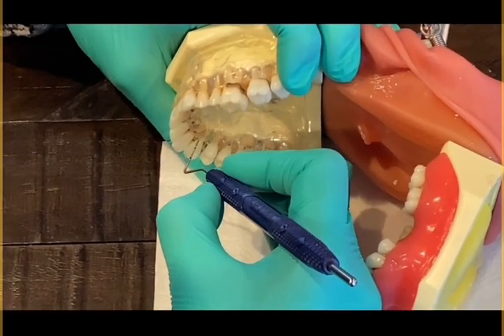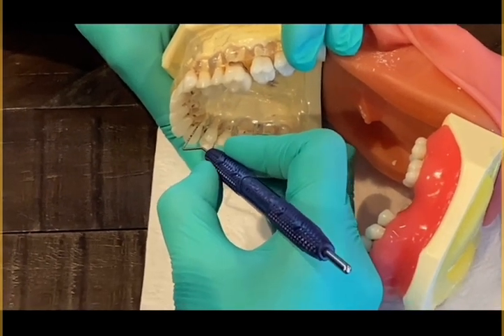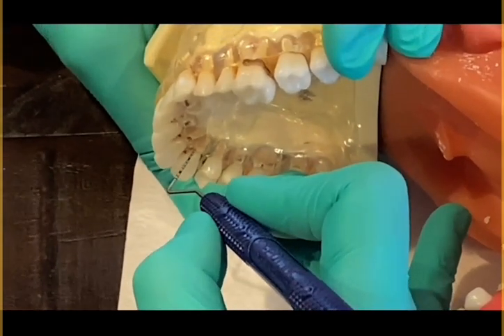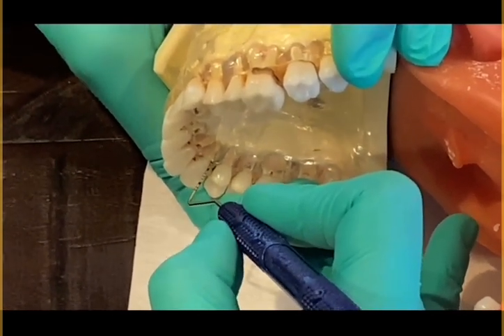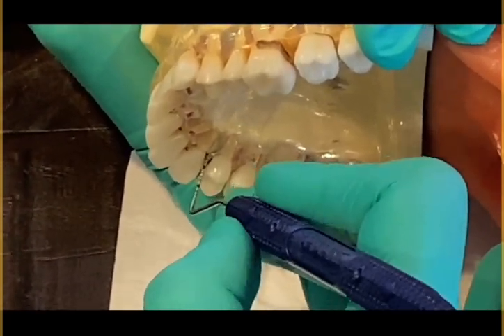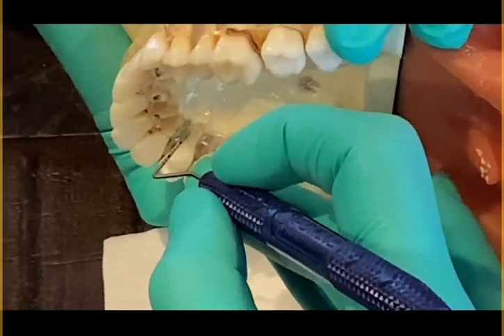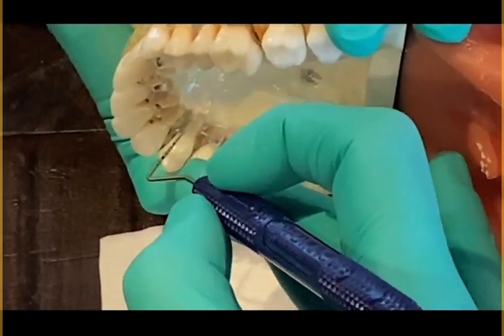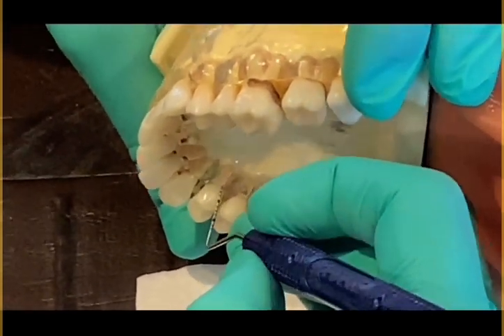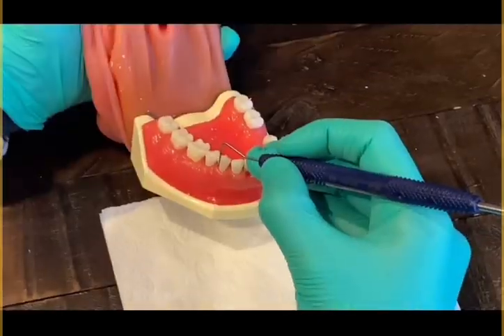Okay, coming back around on number 6. Things change a little bit here since we crossed the midline, so I'm going to start at the mesial line angle. Go into proximal, walk it, 3, mesial line angle, distal line angle, 3, distal line angle into the col space, 3. Then on to number 5, same thing. 5, 4, 6. Now onto the mandible.